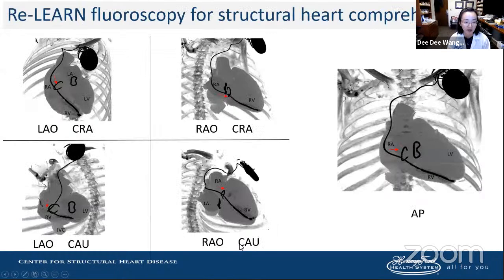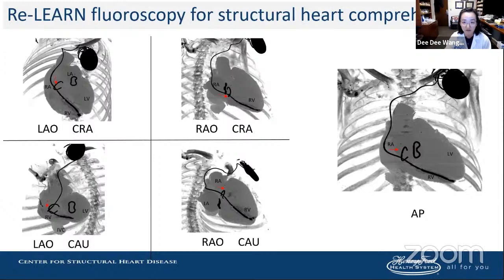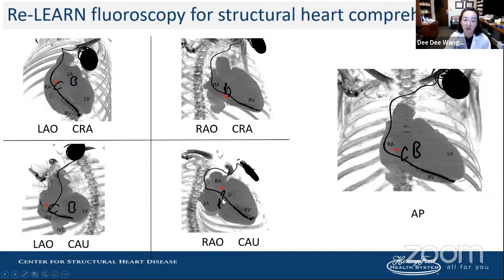In a patient with a mitral surgical ring and tricuspid ring, we relearn fluoroscopy for structural heart interventions by learning the chambers. No longer is it about memorizing vessels, but understanding the four-chamber view, two-chamber view, and three-chamber view. An LAO cranial might be the four-chamber view, and an RAO caudal a better view for the anterior portion. For the tricuspid, an AP view gives a modified three-chamber outflow tract view — things we must anticipate for any tricuspid interventions.